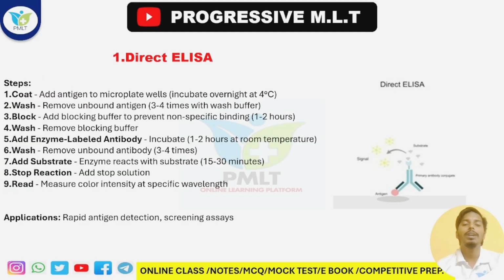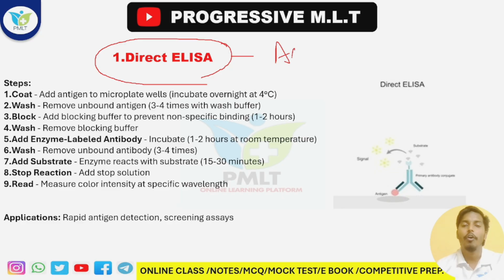First one is the direct ELISA. Please keep in mind that this direct ELISA basically helps to detect the antigen, or the detection of whether the particular antigen is present or not.